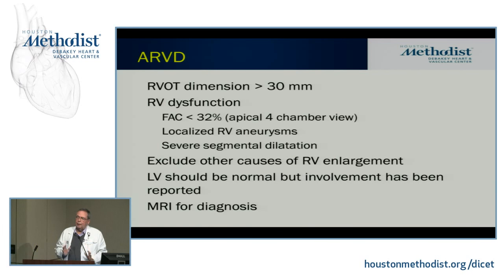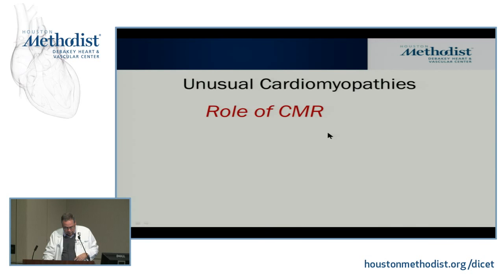But this is part of a constellation of clinical findings and EKG findings. So this is just the imaging part. But as you know, this patient clinically presents with arrhythmias. EKG can have an epsilon wave. So again, it's putting the echo together with a young person that has certain arrhythmia types. They may have even had an episode of quote-unquote sudden death. EKG abnormalities, and then you put it with some echo findings. Today, of course, we have MRI to help us a lot in this diagnosis.